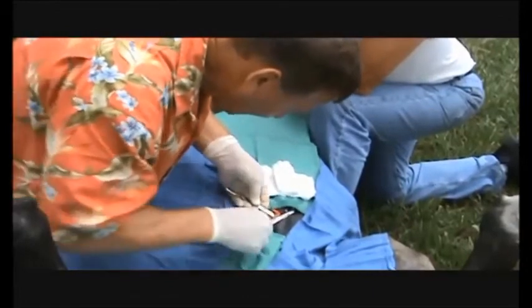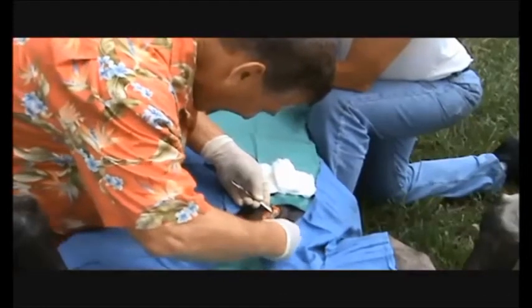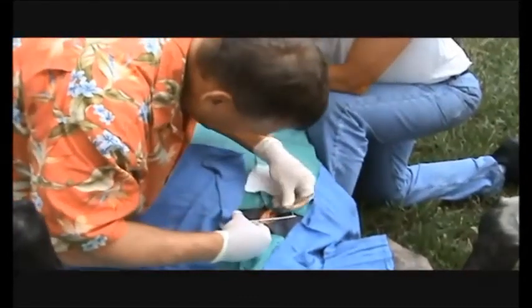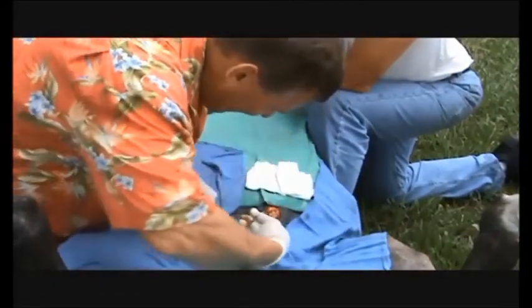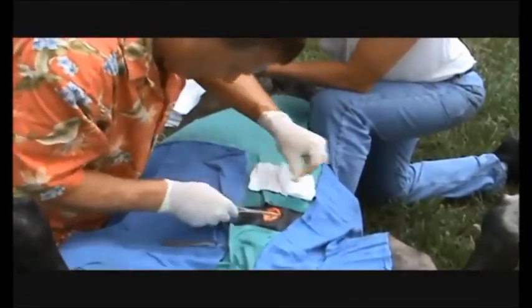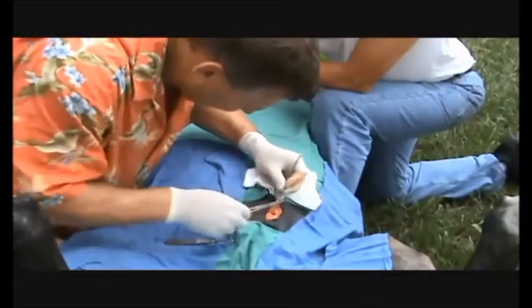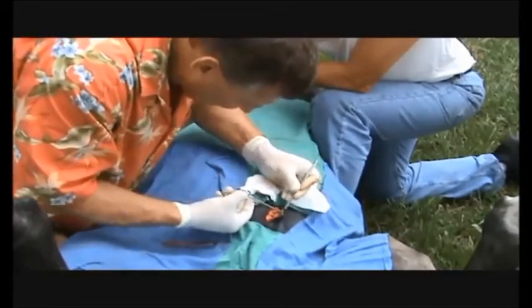And he is doing simple interrupteds. We will do a continuous pattern. People mistakenly think that if they do a bunch of simple interrupteds and one knot fails, all the other knots will hold, and that's actually not true. Because once that one knot fails, all the other ones are put on an uneven pressure and they start to fail really rapidly. So they did some great studies in horses showing that a simple continuous pattern is more effective because the pressure redistributes, and all of your suture distributes the pressure, and nobody fails. So simple continuous is easier, faster, and more effective. We have yet to convince some groups of that, but we close all our horses with it, so you can close your dogs with it too.